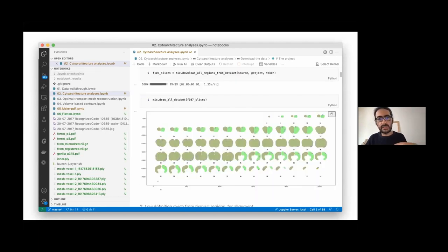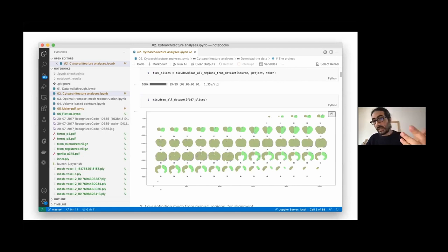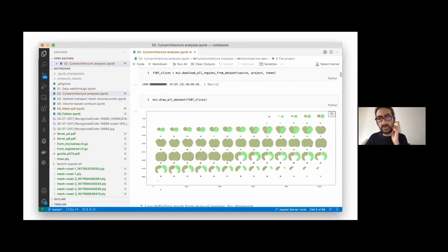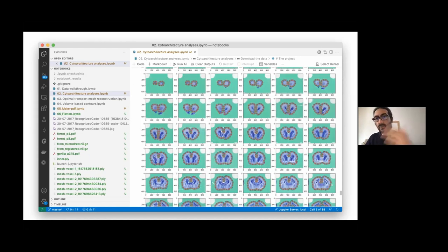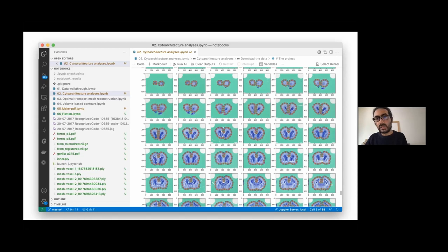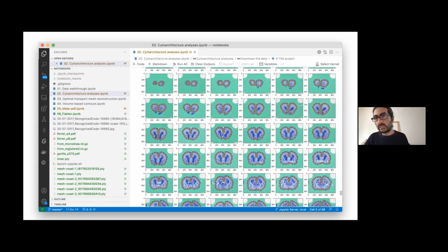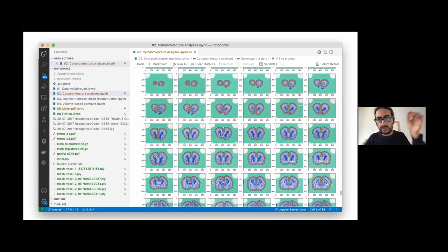So we just code our analysis, we get our data, and then you can download. There's an API in MicroDraw which allows you to get all the data, as Katia showed briefly the last time. And then you can do any fancy analysis that you want. For example, here, we're using an optimal transport alignment to try to get contours and then get the different gray level value changes in our data.